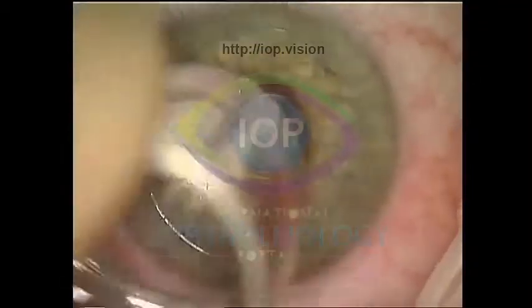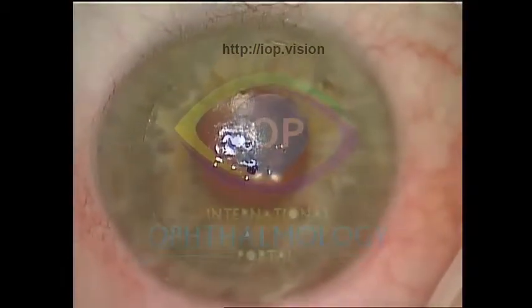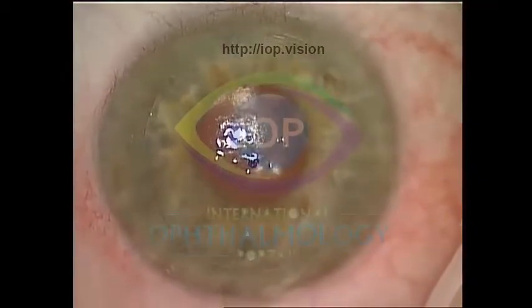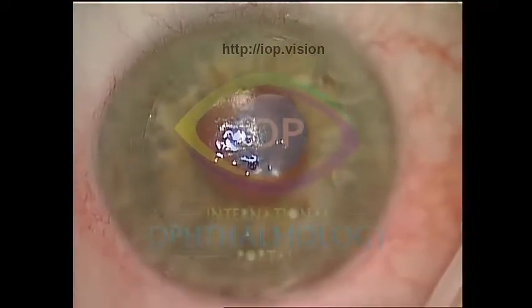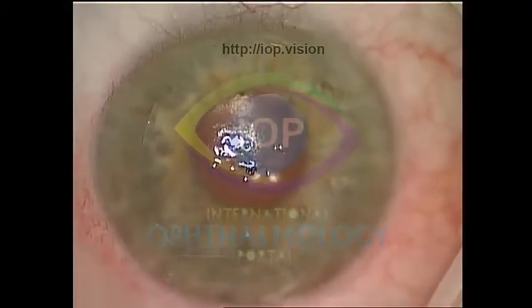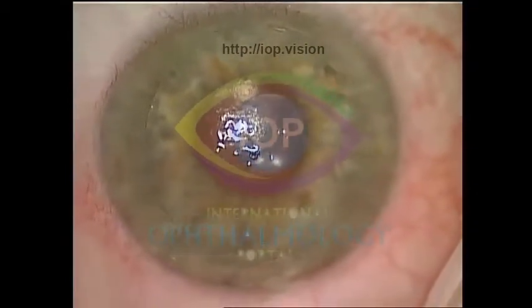And as you know, when you're putting the endothelial graft in, you don't necessarily want it overlapping the corneal incision. So even my paracenteses, I will make them a little bit shallower, a shorter passage, to make them more peripheral in the cornea than my normal paracentesis.